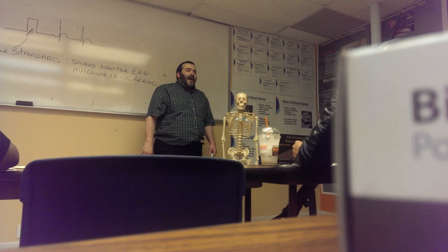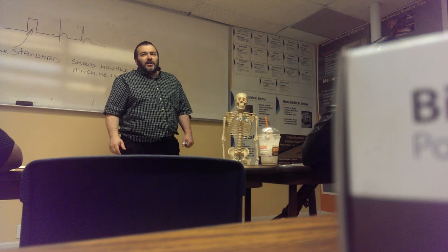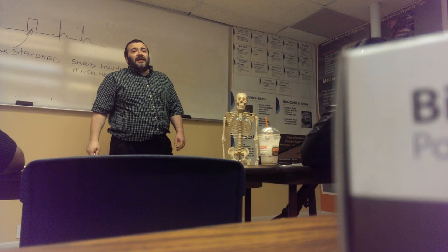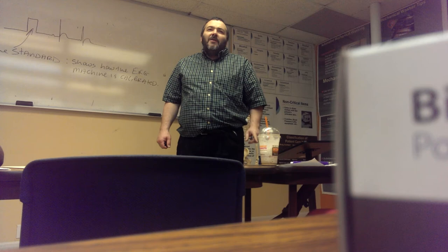Well, that little box shows the doctor all these things: how the machine is calibrated, its voltage, its speed, and so on and so forth. Based on this little box, they can come up with diagnostic information or a diagnosis of somebody's cardiac condition. If the standard is missing, they cannot read the EKG. Therefore, if I ask you on the test a question having to do with a standard, you must remember the following sentence.